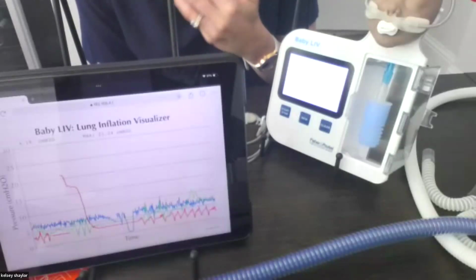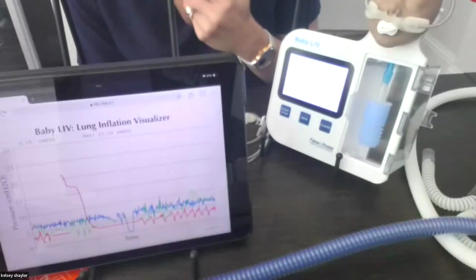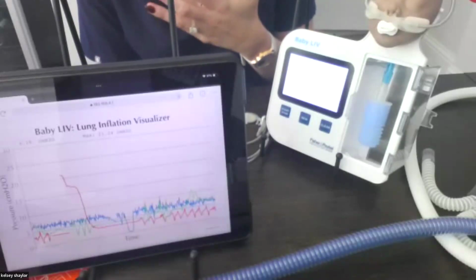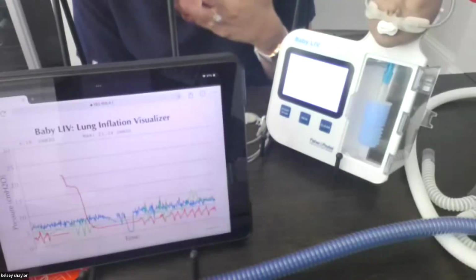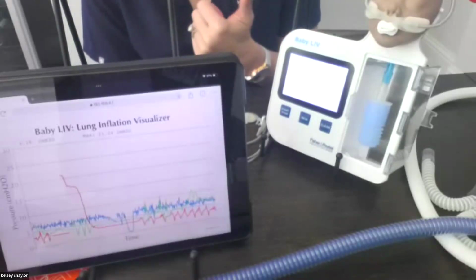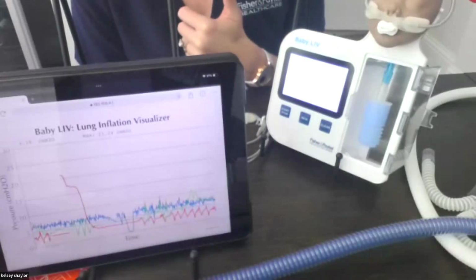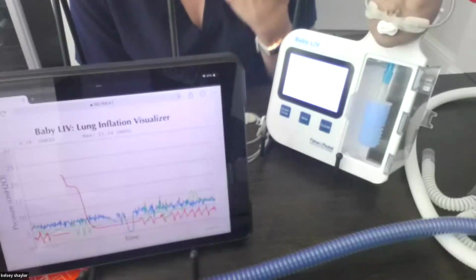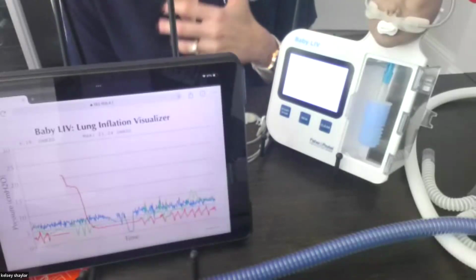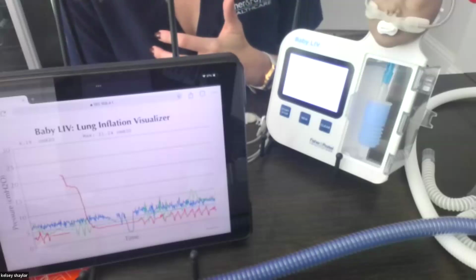So when we go down to those 2 or 3 liters, we're really not providing much support for these kiddos. And at the same time, you're making it harder for them to exhale. So also, I always like to caution people, once you get down to those lower flows when you're weaning, one, you want to make sure your cannula is fit really properly. And that's why about halfway filling the nares is so important. But when we're getting down to those really low flows, think about how much support we're really providing.